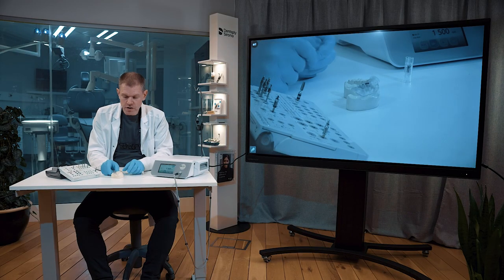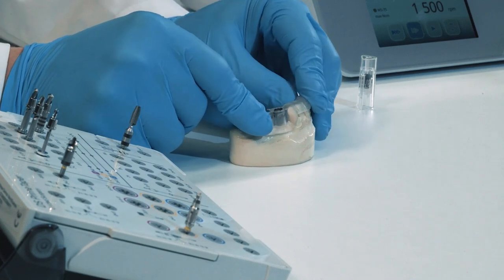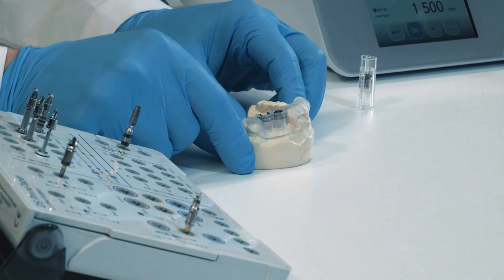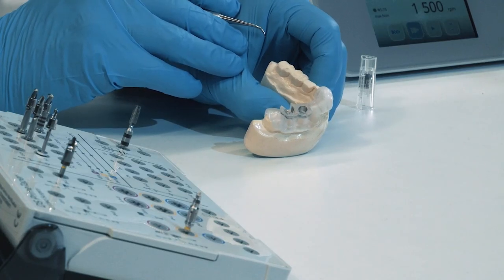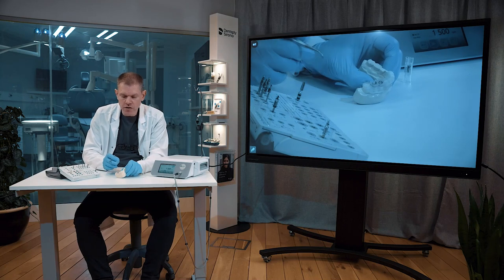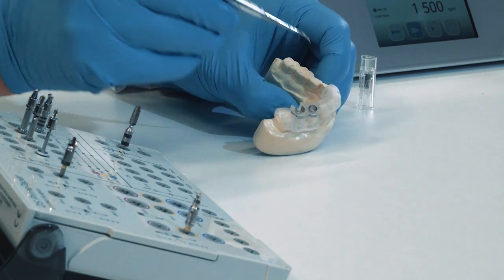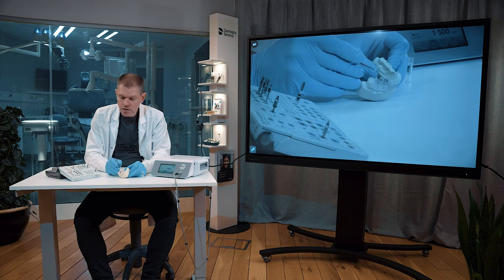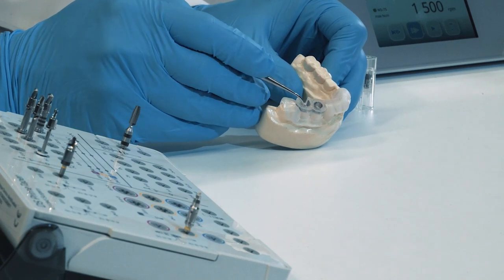First let us look into the guide and the model. You must secure the guide onto the model and feel that it's steady. Looking closer, you can see that there are two different metal tubes, or as we call them guide sleeves. One makes it possible to laterally insert your drills and instruments, and the other is the more standard version that allows you to go from top down. Additionally, there is a specific notch in the guide sleeve that must be aligned with the implant driver at the final stage when you do the implant placement.